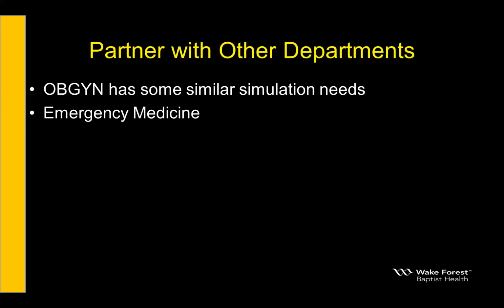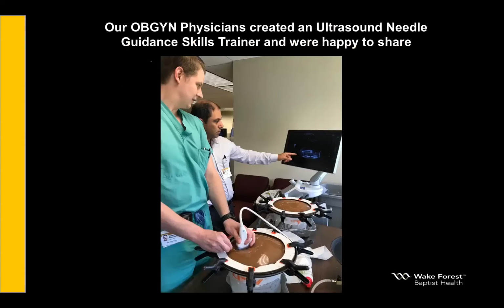Sometimes you can be innovative with partnering with other departments. OBGYN and emergency medicine often have some similar simulation needs to radiology. In fact, our OBGYN physicians had created an ultrasound needle guidance skills trainer to help with targeting lesions, and they were happy to share that with us.